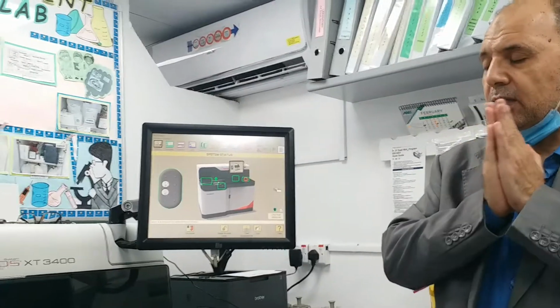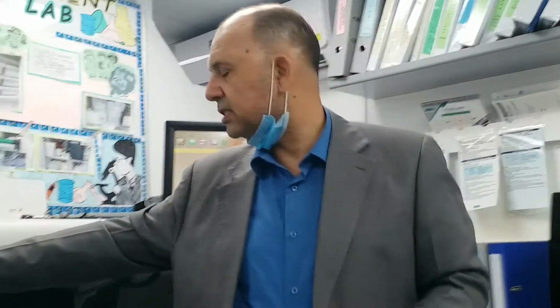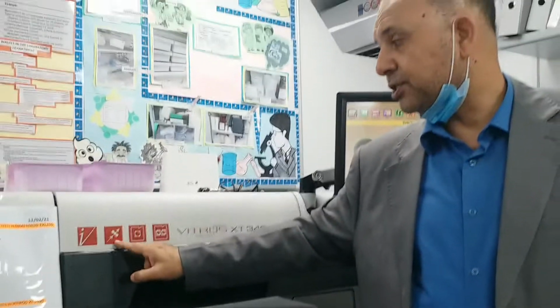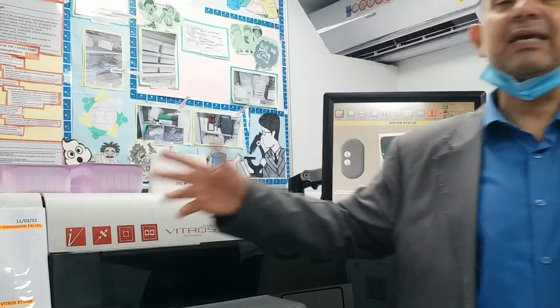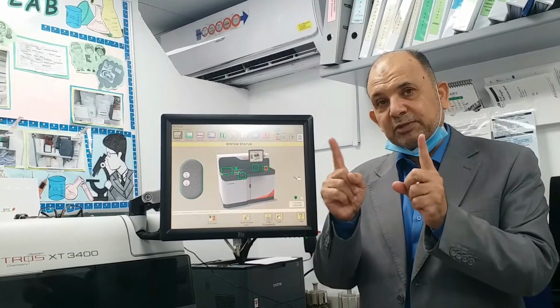For the time being, we have something called IntelliCheck. I'll tell you the meaning of this and of the other. IntelliCheck: the analyzer checks each result because we have a special limit.